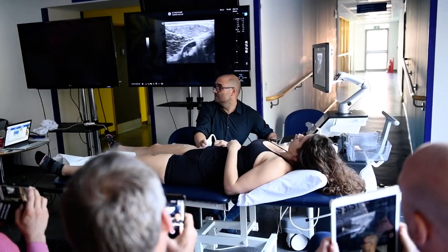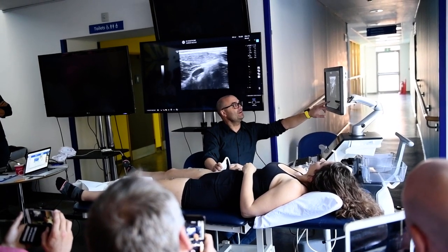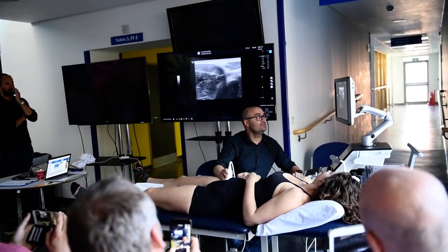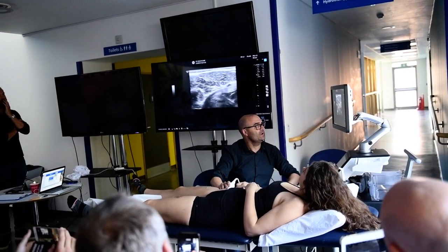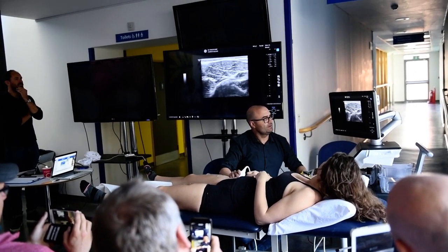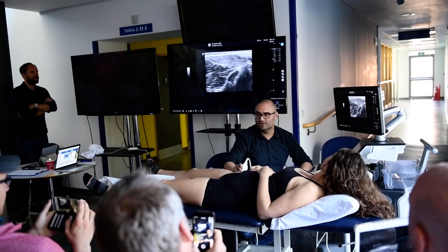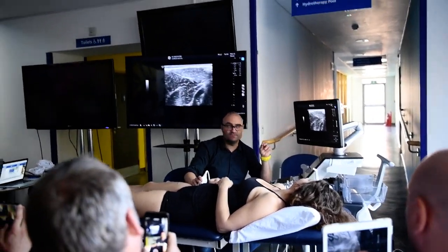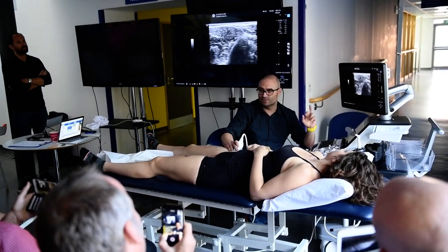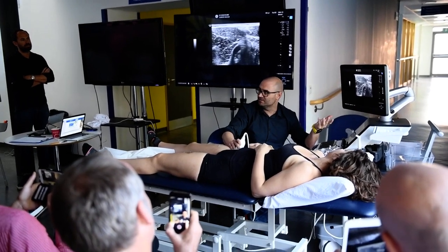But this is not a good scar — there's nothing there, it's fluid. So this should be an indirect tendon. Are there any fibers intact of the indirect? Yeah, there are fibers completely intact. So this is the way you can see the indirect tendon. But if you look further here — in the most deeper part of the indirect tendon, that's why I said it could be a paralabral cyst. It is really attached to the capsule, as we said before. So we really don't know if this liquid came from the indirect tendon itself or it's coming from the hip joint.